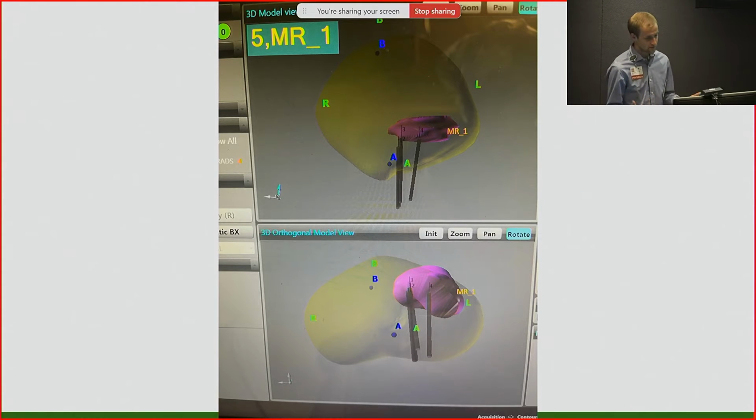Now, that means a couple things. One, you have to have the software. So we have a little bit of a traveling roadshow situation here where we share the technology, the software, essentially the machine, with a bunch of other urologists in the state. And so I try to lump these together on certain days, do 3, 4, 5 of them, and then knock them out all at once. Just logistically, that works pretty well. But when you're doing the procedure, you make your circle, and you put the two images together.